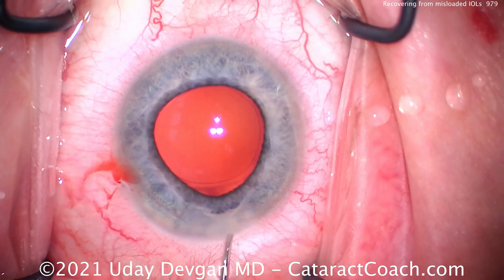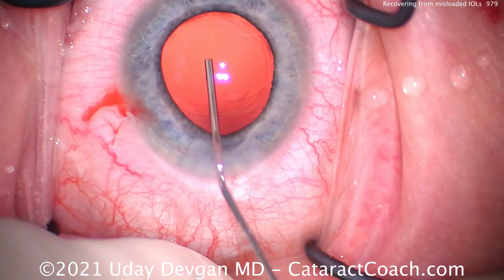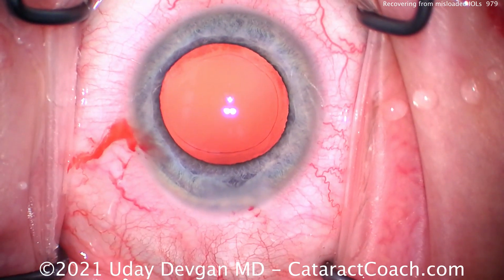Here's the next one. Again, pretty routine — cataracts out, a little bit of a floppy iris. We're going to fill our capsular bag here with the cohesive viscoelastic. That's a nice, good fill. Very nice. Beautiful rhexis. And now let's get the lens.